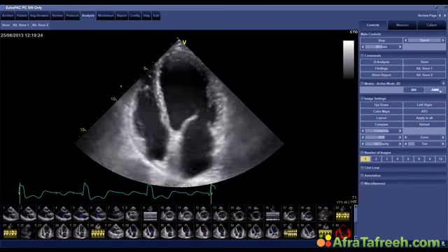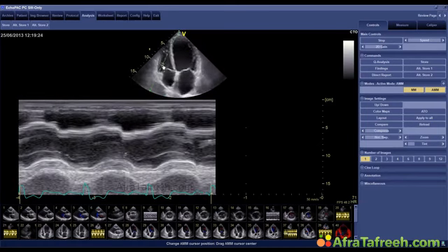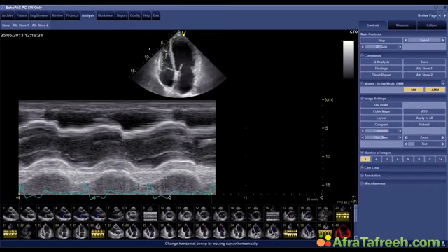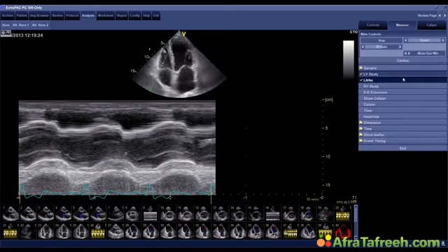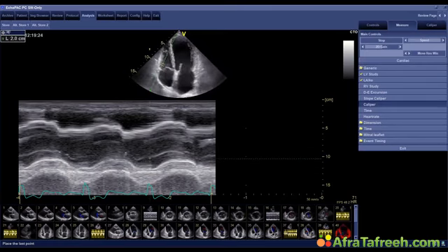And if you want to be even more specific, what you can do is you can do the so-called TAPSE, where you basically put an M mode here into the annulus of the tricuspid valve, and then you observe the motion, and all you need to do then is just simply measure from here to here, and the normal measurements would be somewhere in the range of 17, 18. In this case, pretty normal right ventricular function. Right? You see it moving.